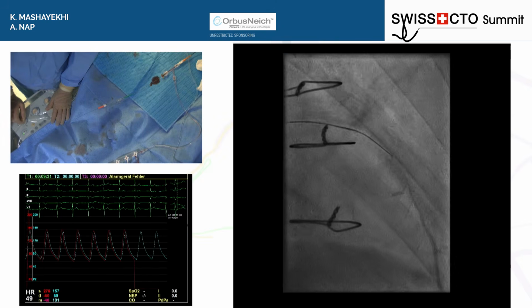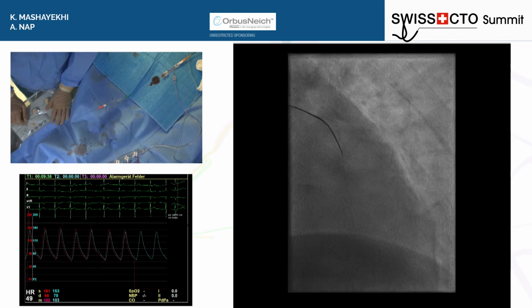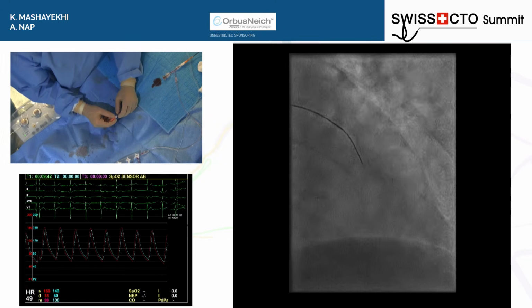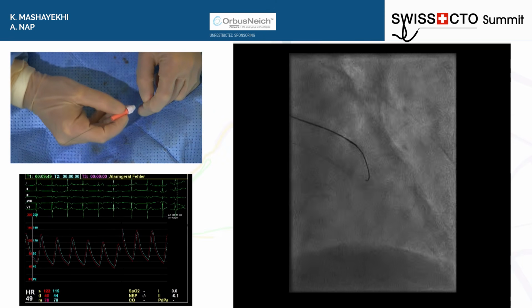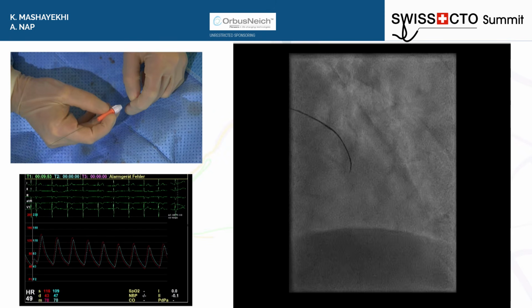But the way out at the distal cap is also a key point. Subintimal. It's subintimal, yeah. It's very important because this is now the most interesting point, how to cross here. Any thoughts for the audience who would proceed this way, who would do something else? The same wire, other wire?